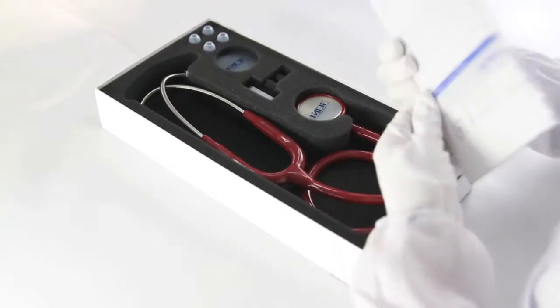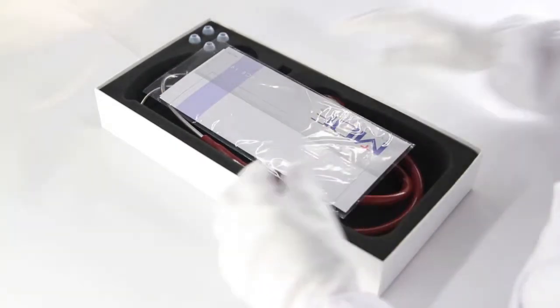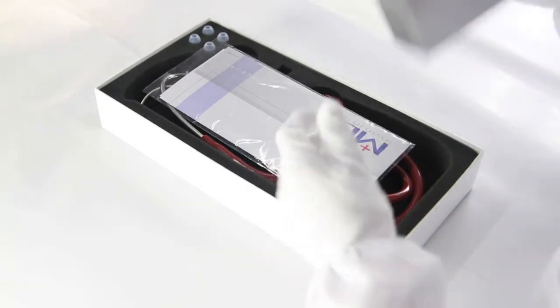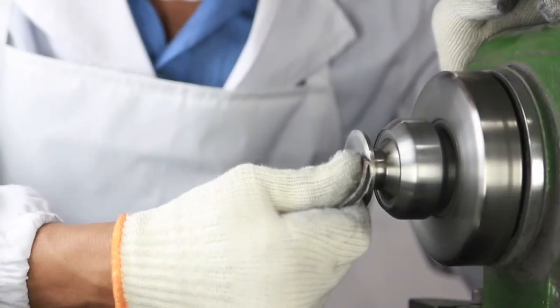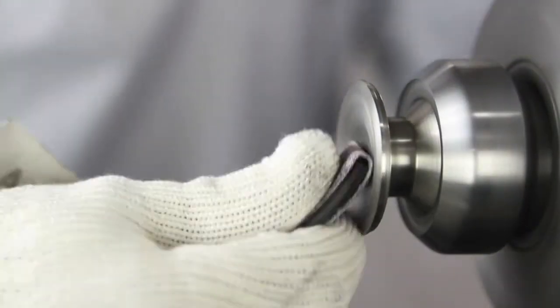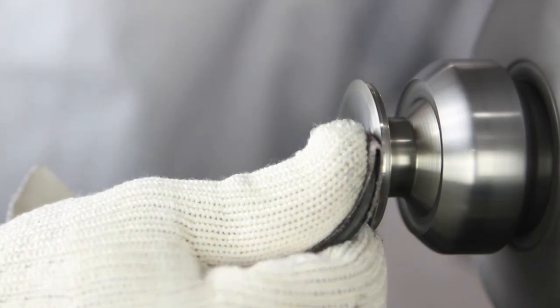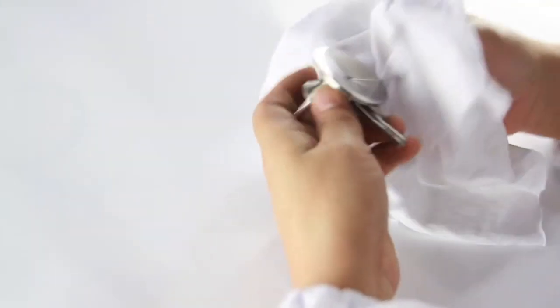Like all of our stethoscopes, the Pulse Time is covered by a full lifetime warranty even on the tubing and it has our clear silicone ear tips and those are covered by our free parts for life program. So anytime you need ear tips or an ID tag or a diaphragm, it's free. We're able to offer industry-leading warranties because all of our products are handcrafted for the best possible quality and that's what we've been doing since 1971.